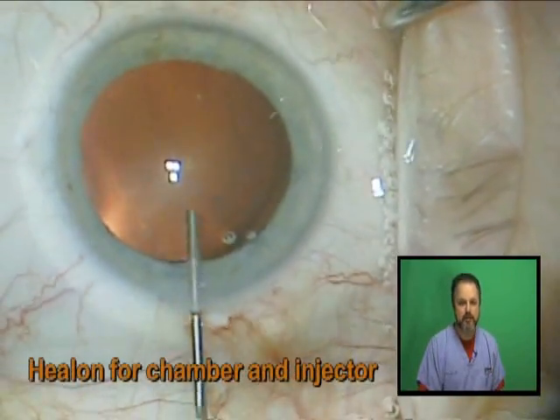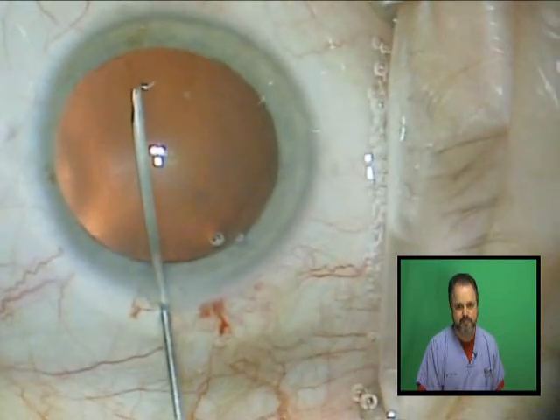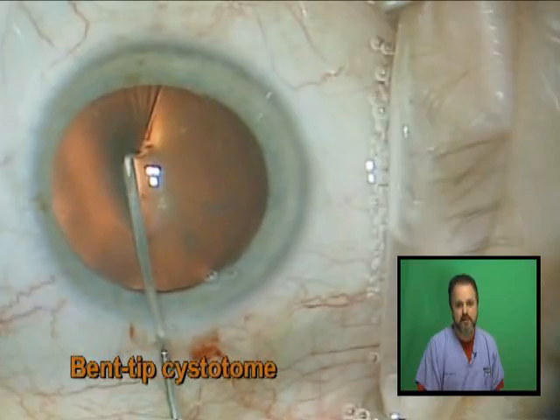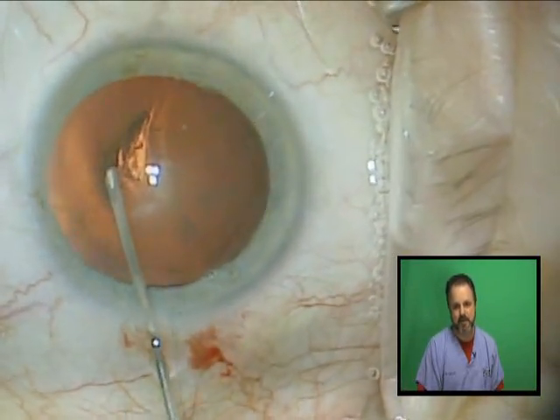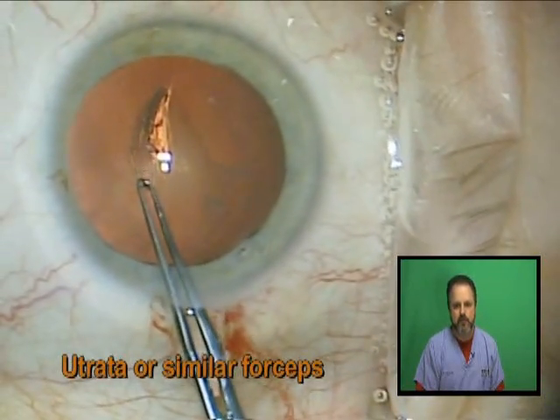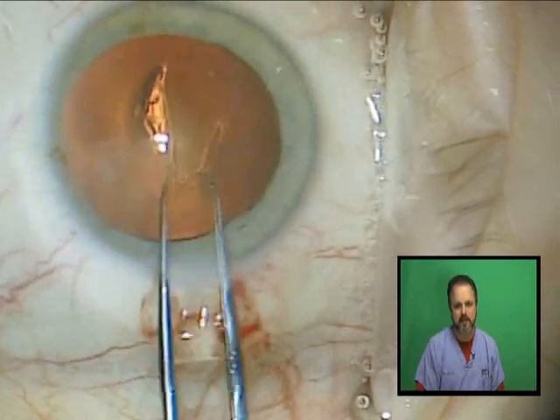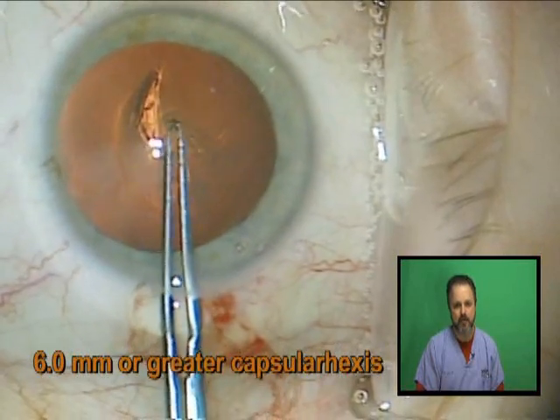Next I will fill the anterior chamber with viscoelastic to protect the cornea. I then use a bent-tipped cystitome to begin a 6 millimeter capsulorhexis following my template. With the new 5.0 lens I prefer 6 millimeters or more when I tear my capsulorhexis, and I keep it round.